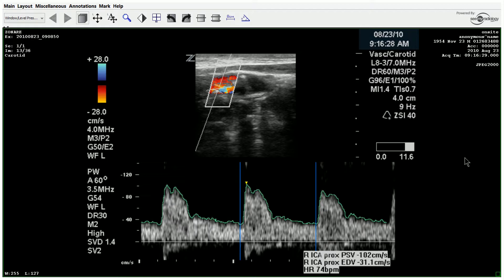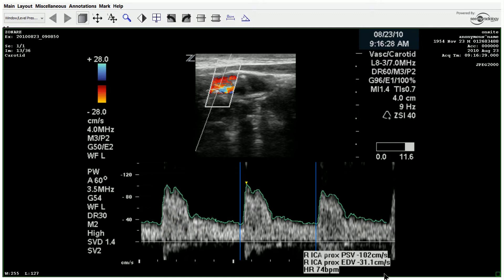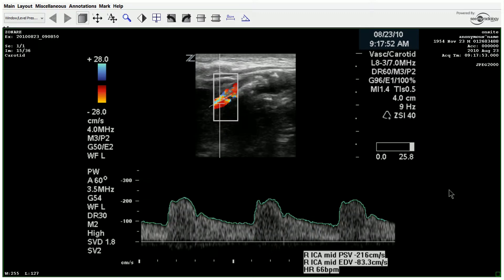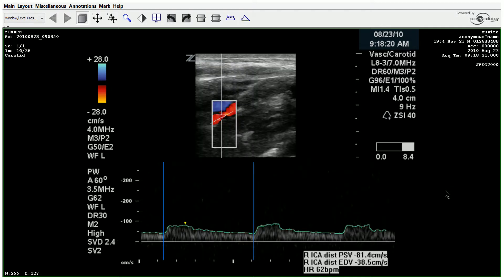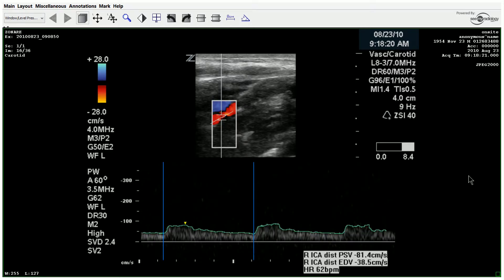Moving to the ICA proximally — the sonographer was actually able to get a very proximal measurement because this looks like the bulb here, so they likely changed positions on the neck to get that proximal velocity. The proximal velocity was 102 cm/s, and just post that large impressive plaque we saw, we get 197 cm/s, then another sample at 216 cm/s.